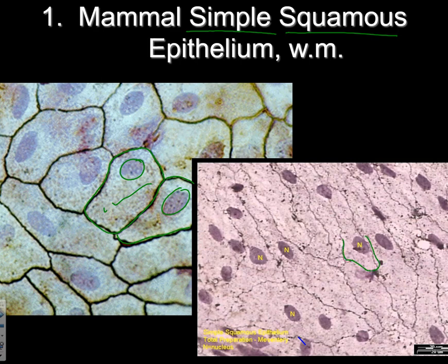My drawing's not going to be perfect because I'm using my smartboard and it's not perfectly calibrated. But that looks to be about the cell membrane and the nucleus here. And we can see some nuclei. This nucleus looks like it's crossing over between a cell that's over here and a cell that's under here. And that has to do with just a little bit of overlap in what we're seeing in the slide itself.